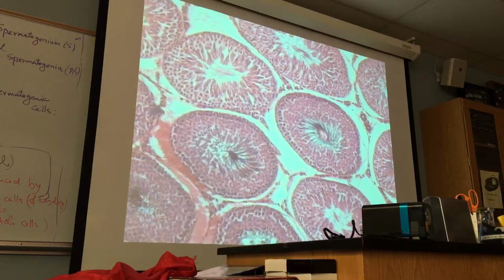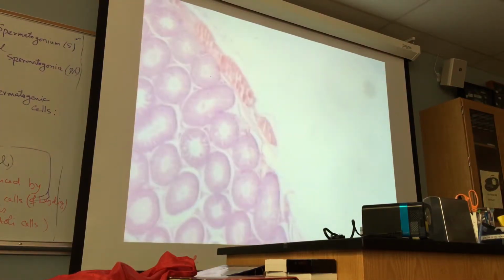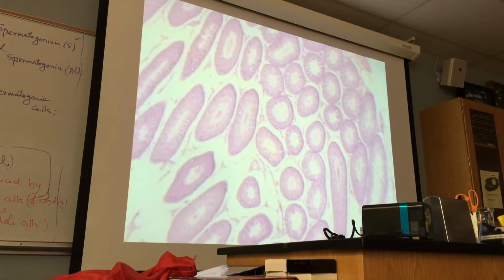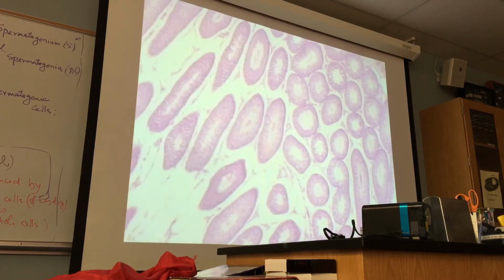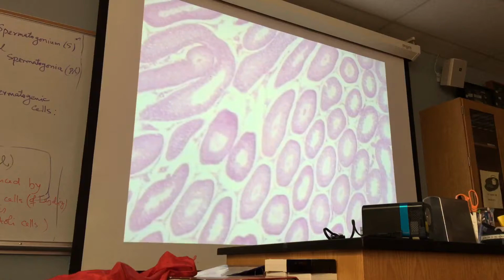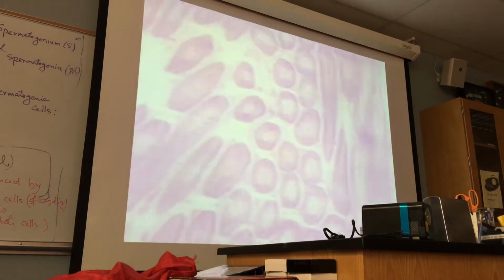Any problem? It's very clear. I have another slide to show seminiferous tubules. These are seminiferous tubules, and they come in various planes.